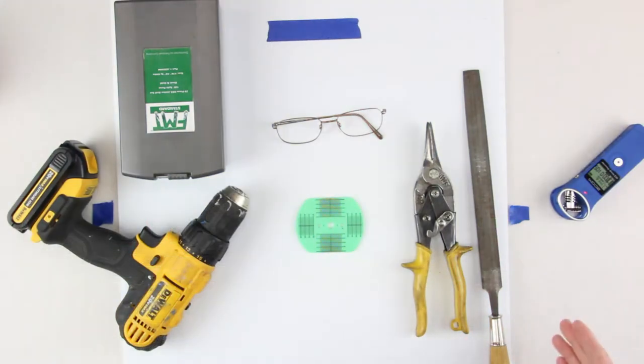I need to create a set of four identical lenses. And I want those lenses to be a very unique shape with some very unique features. So rather than just do that behind the scenes, I'm going to actually let you watch what I'm doing, talk about it a little bit, and I think maybe you'll get a better idea about some of the things you can do by hand and just how much some of these lenses can take.